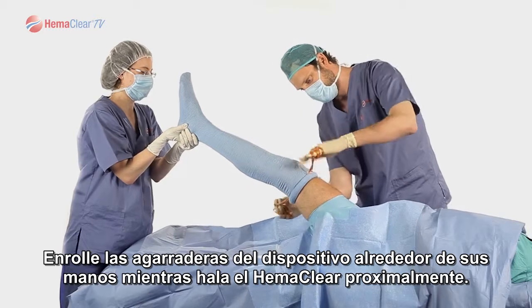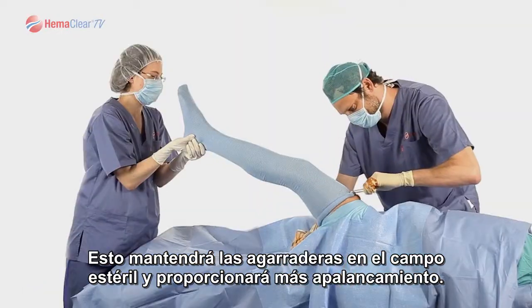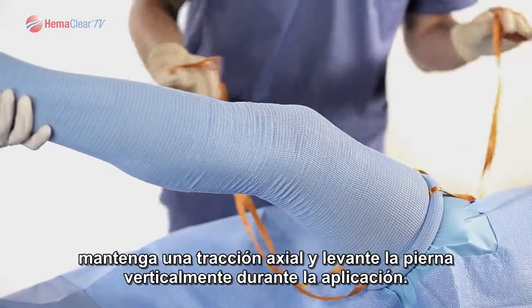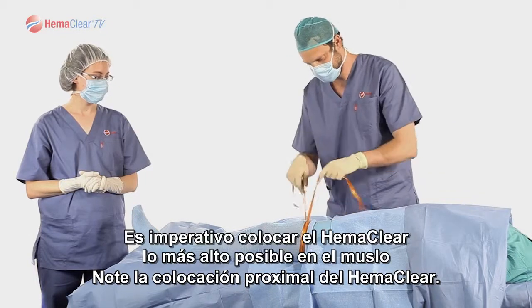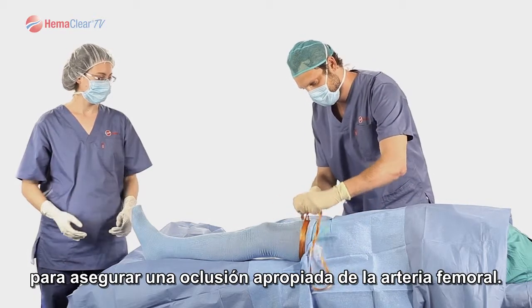Wrap the straps of the device around your hands as you pull Hemoclear proximally. This will keep the straps within the sterile field and provide more leverage. It is helpful if the team member holding the foot maintains axial traction and lifts the leg vertically during application. Note the proximal placement of the Hemoclear. It is imperative to place Hemoclear as high as possible on the thigh to ensure proper occlusion of the femoral artery.